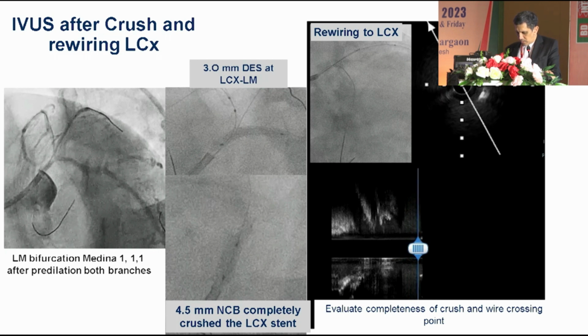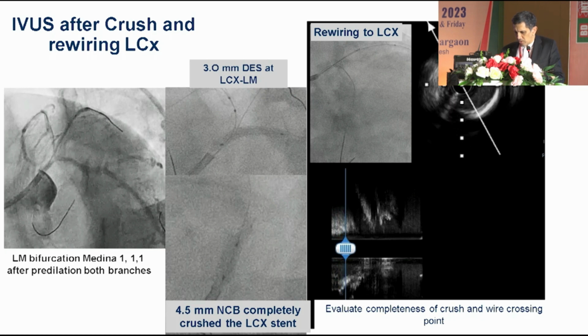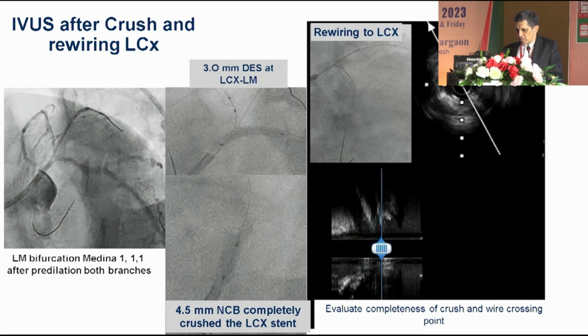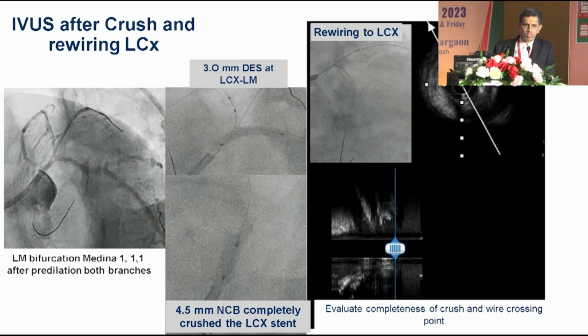So look at this. Because of interest of time, you can use IVUS actually to make sure. This is longitudinal, this is the wire. So this is the distal part, and then coming the wire. So this is really the wire, not gone to the abluminal part.